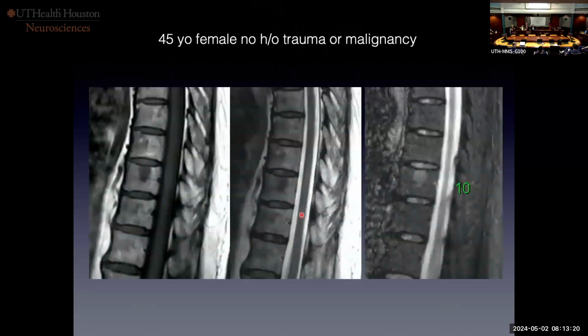Yeah. We don't do much diffusion for spine. How good is it? Are there limitations? All of our spines have diffusion. We've gotten way better. So that's standard now? All of our spines have diffusion, okay. Well, all of our inpatient and ER spines and many of our outpatients, all the ones done at TMC do. It's been super. You do get a standard sagittal. And is that pretty good for abscess? Absolutely, yeah. So, abscess, yes, but also remember that hematomas can restrict. Sure, you know, right?